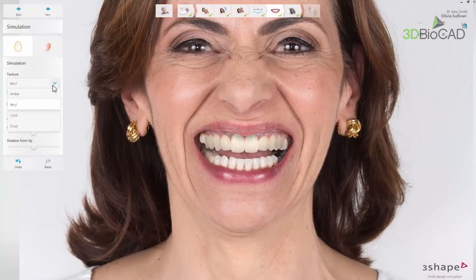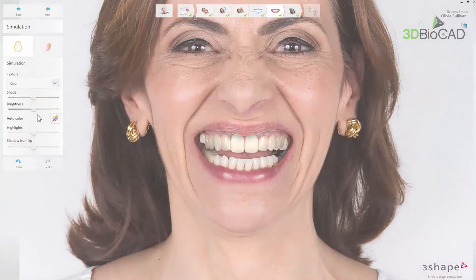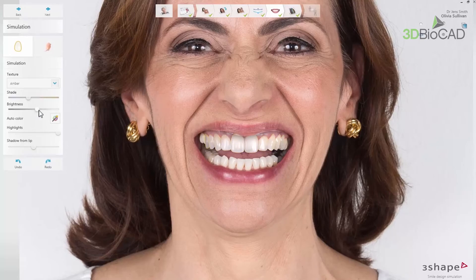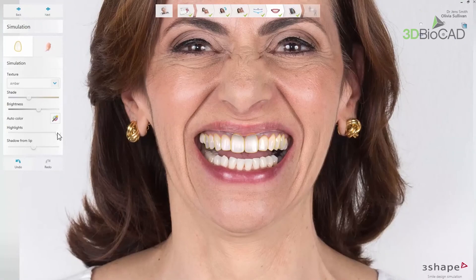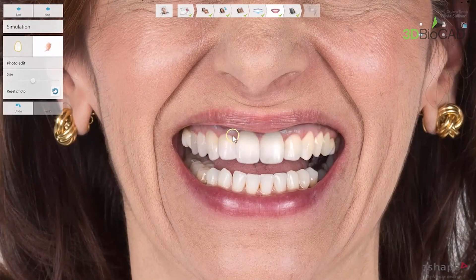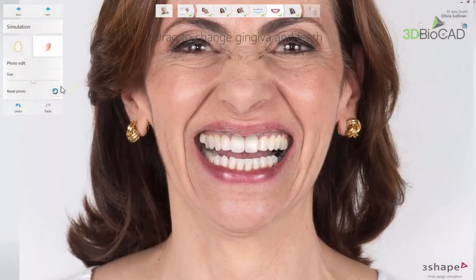In the next step, you can use the simulation tool, where you can change the texture library on the teeth. Using the sliders, you can also adjust the shade and brightness of the simulation. It can be done for all the teeth involved or just for some of them. Use auto-color to restore to default. Highlights and shadow from the lip can also be adjusted for even more realistic simulation. This can also be improved by the photo edit tool, allowing gum adjustment if necessary. The size of that tool can be changed using the slider or by holding shift and mouse scroll.